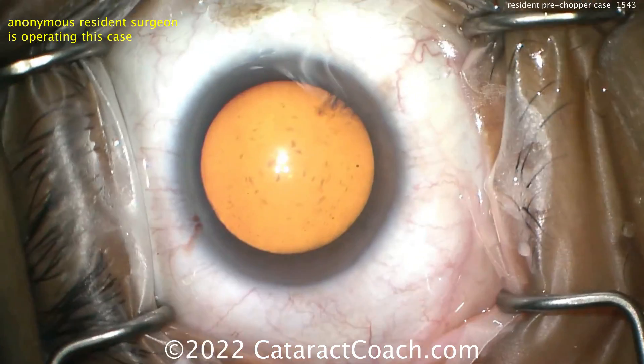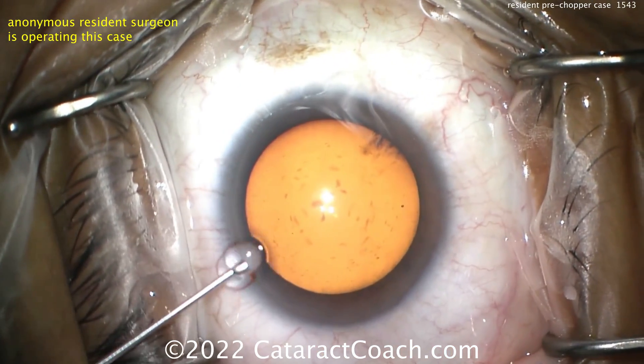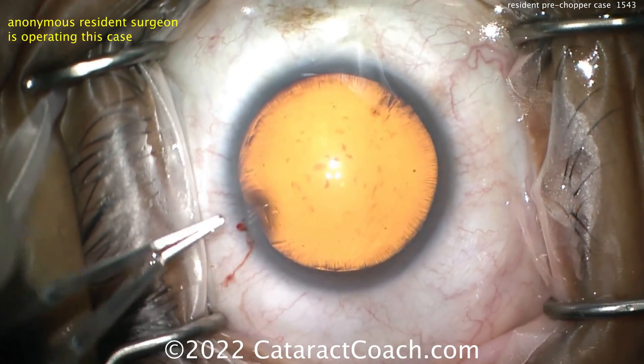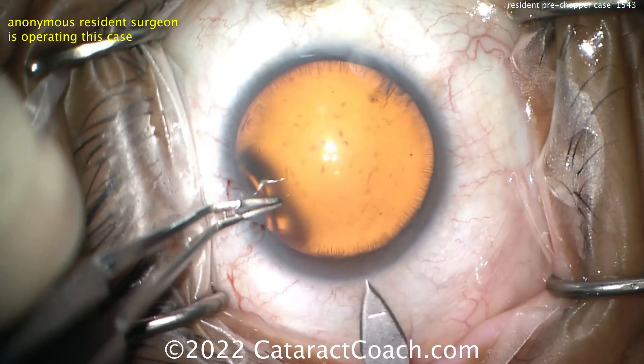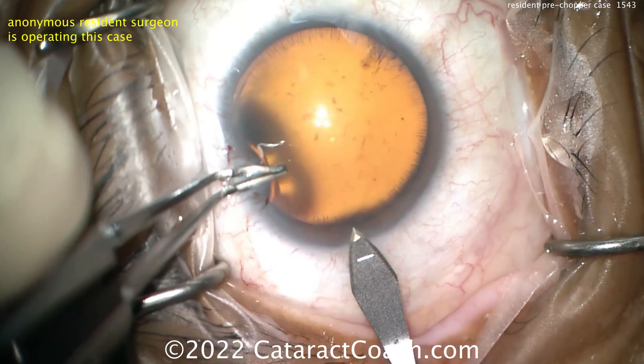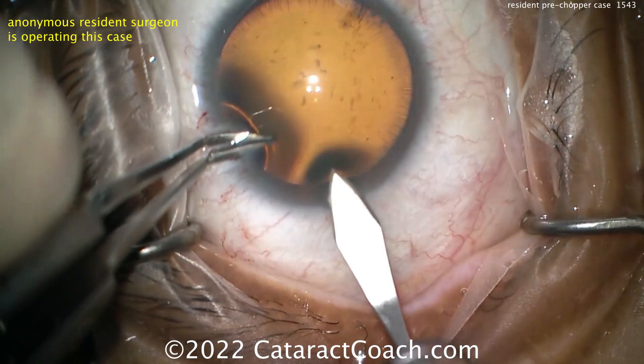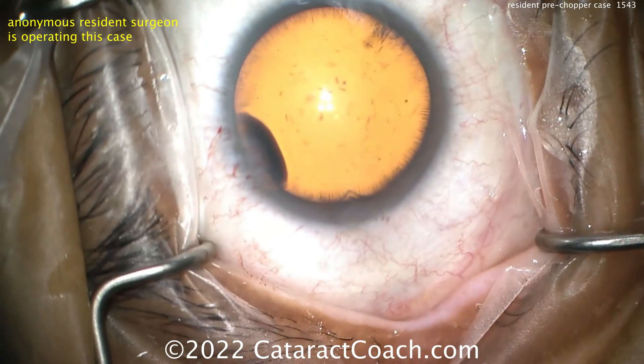Anesthetic is being placed inside the anterior chamber and now viscoelastic is going inside the eye. It's a nice-looking field — beautiful dilation, you can even see the zonular attachments. Here's the main incision. Let's watch carefully — looks pretty reasonable, good tunnel length.